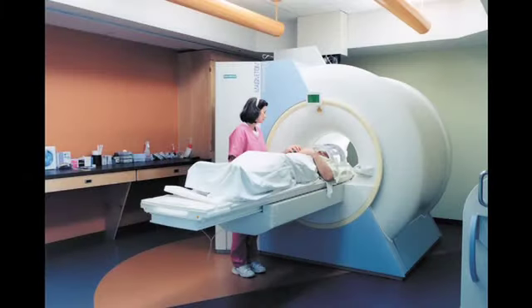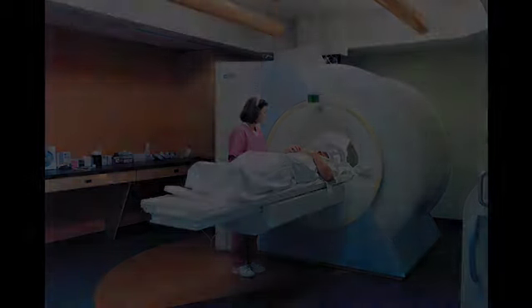So there we have it, T1 and T2, measurements that can mark the difference between biological tissues. But how do we progress to imaging? Magnetic resonance imaging. Now we can explore the process of acquiring an image.